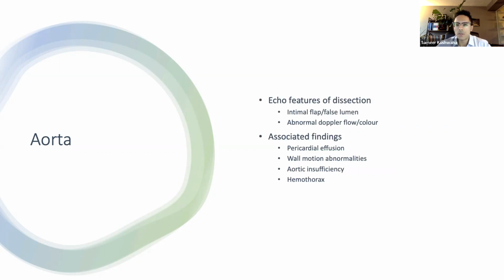So there are a few key features to look for dissection on echo. We look for an intimal flap with the development of a false and a true lumen. We can look for blood flow in the true versus the false lumen, and we would expect to see that the true lumen has higher flows and an increased diameter in systole, as one would expect of any artery. Whereas in the false lumen, we see poor flow, and we see that its size generally decreases in systole, and we get increased flow and increased size of the false lumen in diastole.